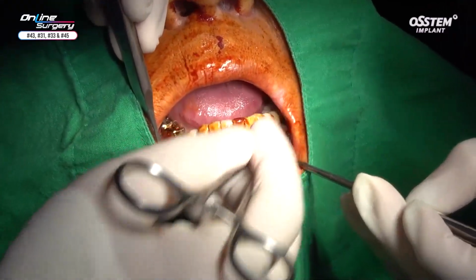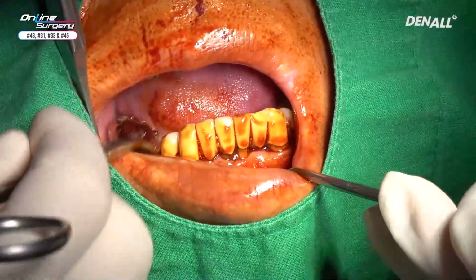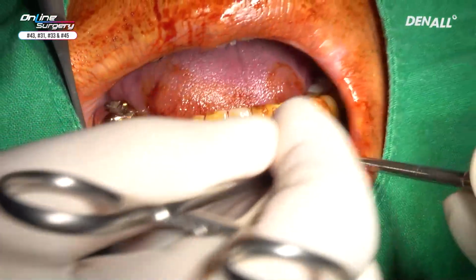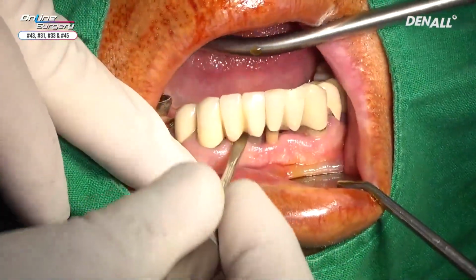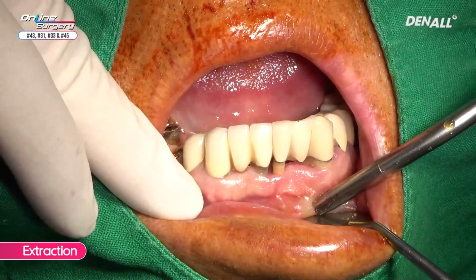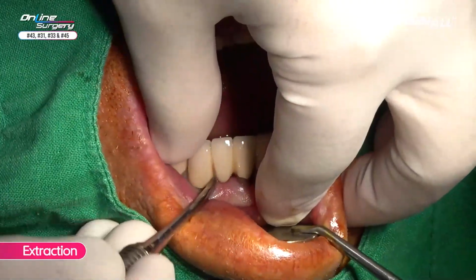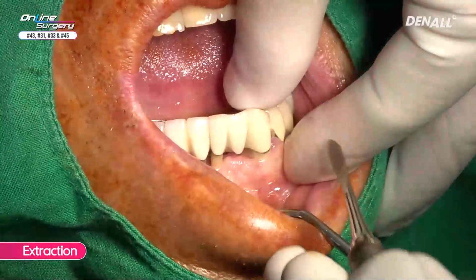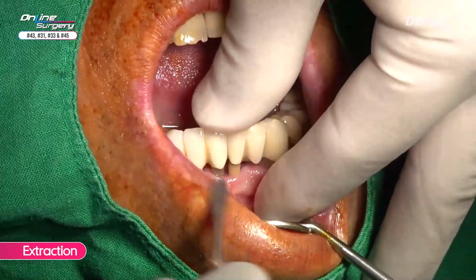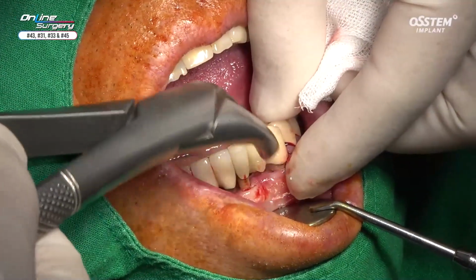There is a 6-unit bridge between canine and canine. Immediate implant placement will be done after removal. There's root rest in number 5. This is going to be addressed next time. I prefer perio steel elevator number 9. Bridge is connected. When you do extraction, what is most important is to get the fulcrum. So bridge is divided in the center.